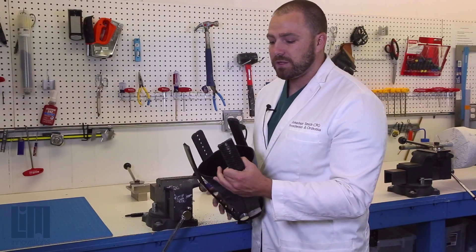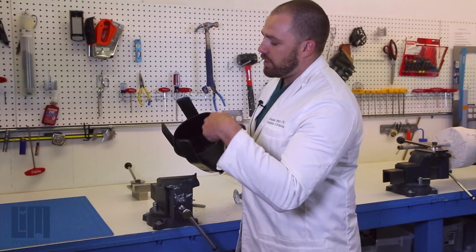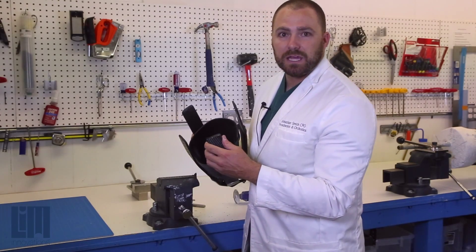What you'll notice is that the edges are quite sharp after cutting. So after you've gone through and cut all four struts, we need to go into the machine room and bevel and polish up these edges, and then we'll be all set.